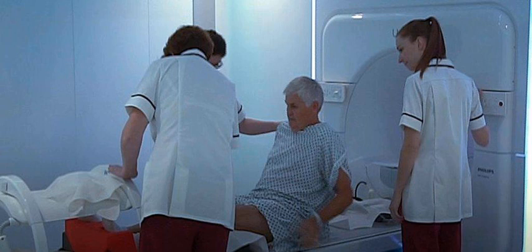The machine has been specially designed so that the magnet coils of the MRI and the X-ray beam of the linear accelerator do not interfere in any way. It will be particularly helpful in treating tumors that change in size and shape in the body, such as in the lung, bladder and bowel.